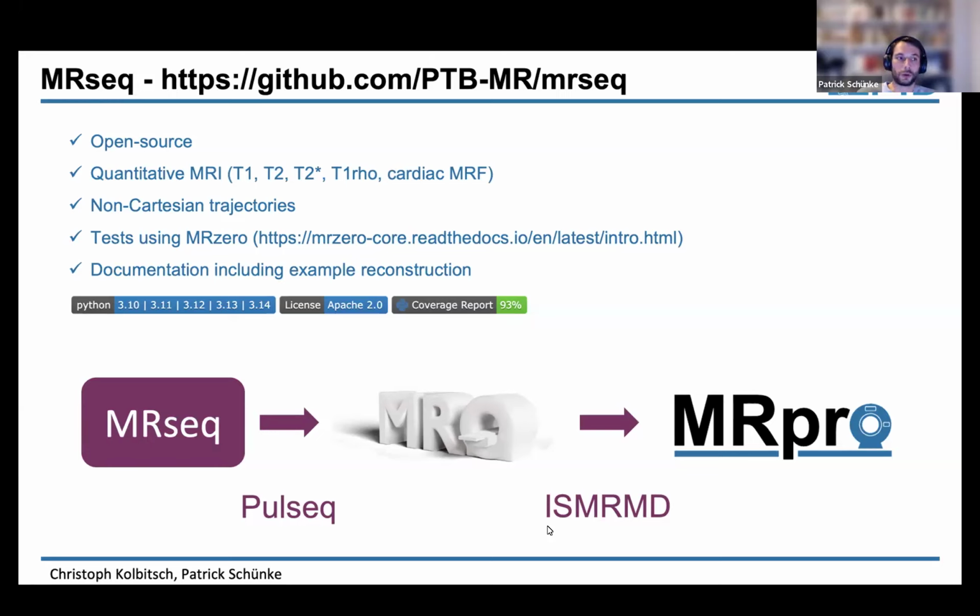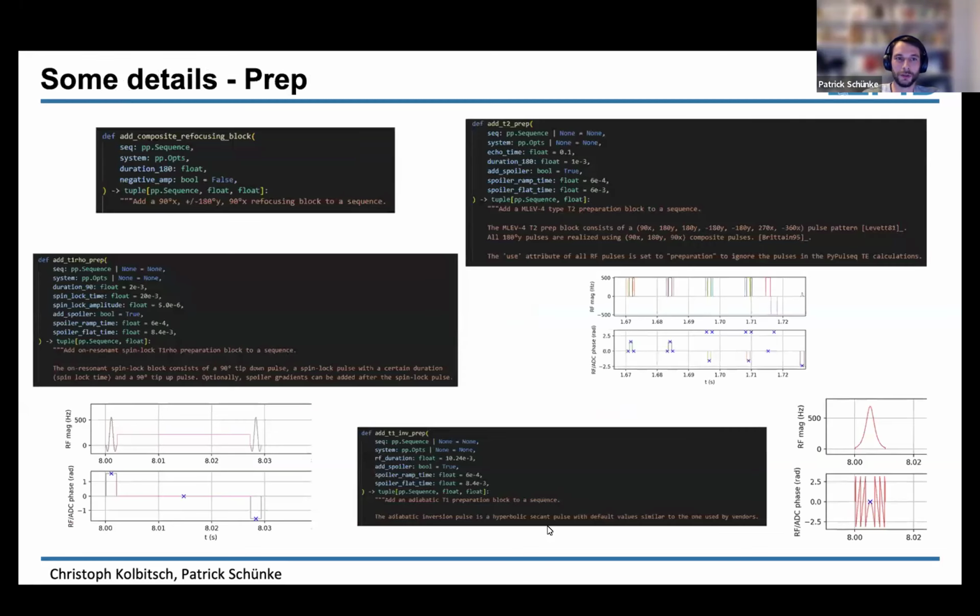Especially in quantitative MRI, where we get quantitative results, this is very useful and a good quality check. We actually still found some minor errors in our sequences that we were sure were 100% accurate. So even for us, it's already a very good result. Okay, so I think we can continue.